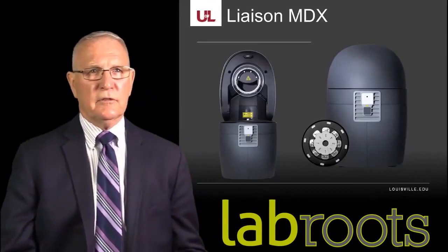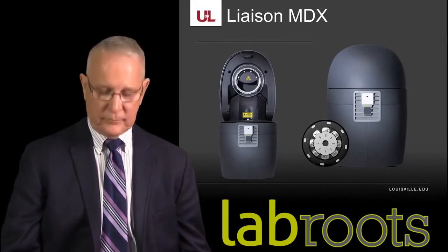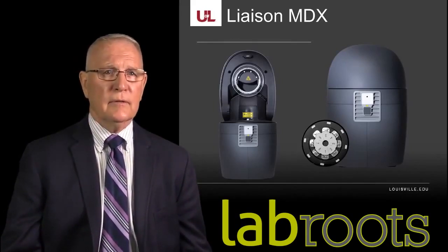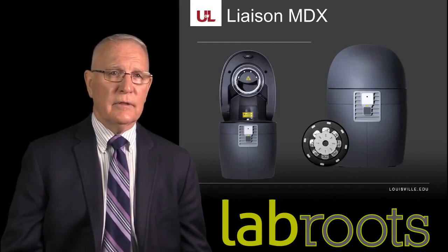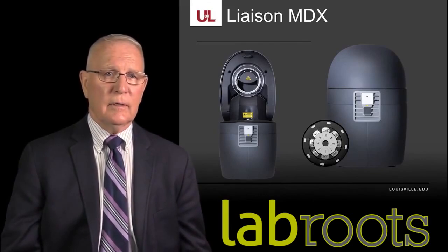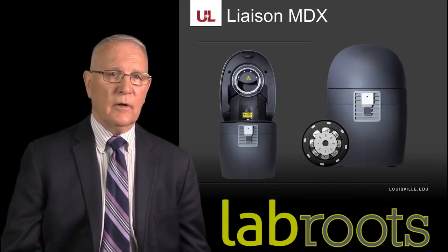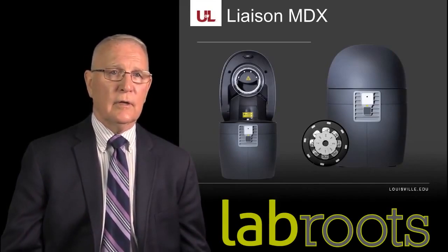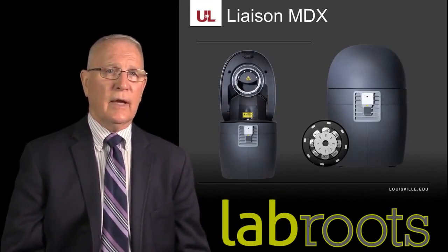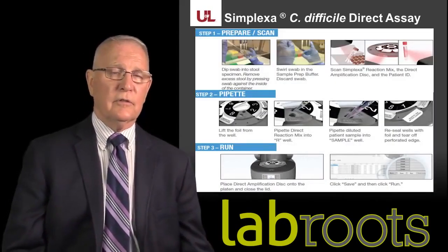What you're looking at is the Diasorin instrument known as the Liaison MDX. And the system is very conveniently, from a space point of view, accommodated in a laboratory. You'll notice there is a disk, and that is the focus of the testing platform in the system. And the next slide will show you how this assay is prepared and placed on the disk for detection in the instrument itself.